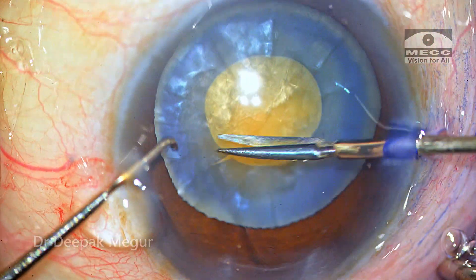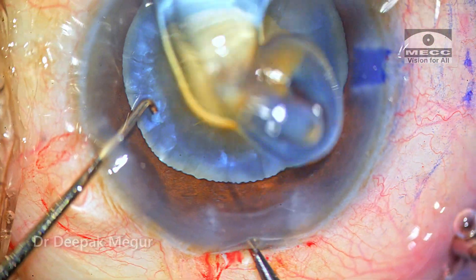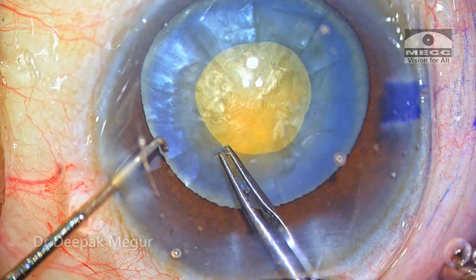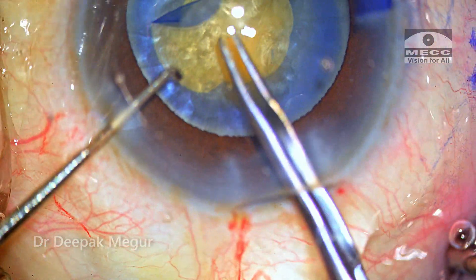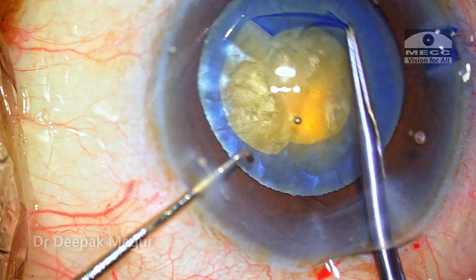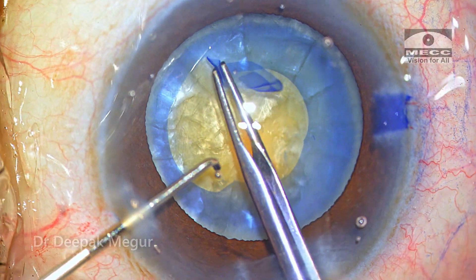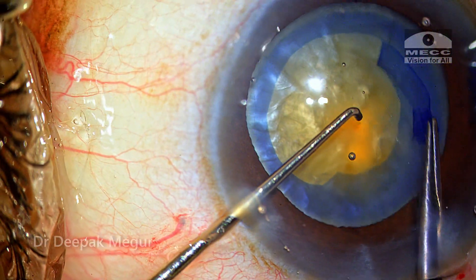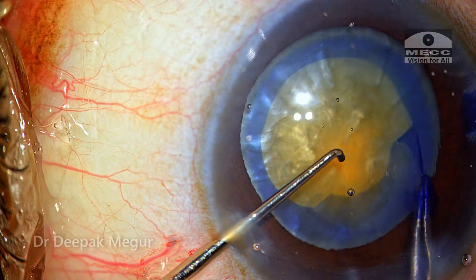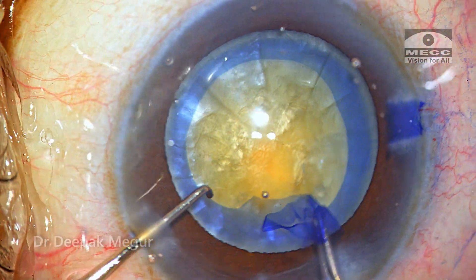A tangential cut is necessary; otherwise it can extend radially — this one is more like a radial cut, which is not really advisable. Now because the eye is soft and the swollen lens has been decompressed, handling this flap is going to be much easier. Going back to my forceps, the secondary rhexis of about 5 to 5.5 mm can be very easily created. The critical factor for this is ensuring the bag is well decompressed so the capsule can be controlled very well.